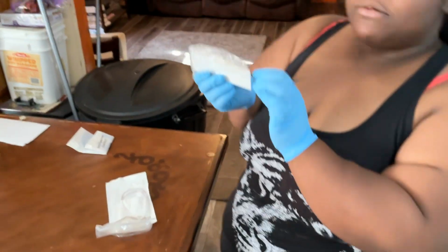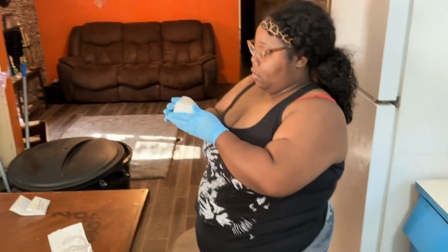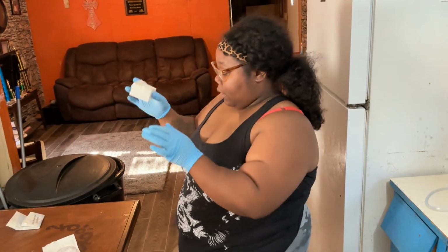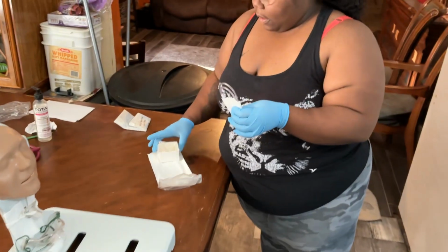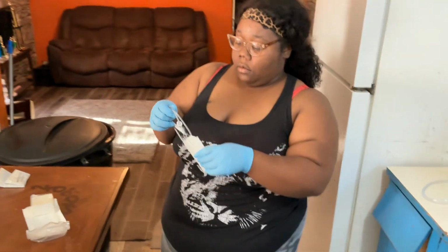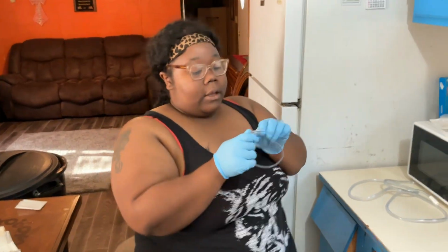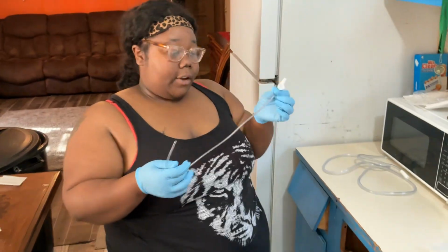At this moment, I am still sterile. I'm just fixing this. Okay, get my cup situated. It is still considered sterile. Here above my waist, I'm going to take my non-dominant hand, which will become my dirty hand.